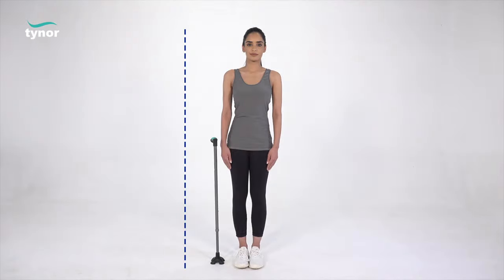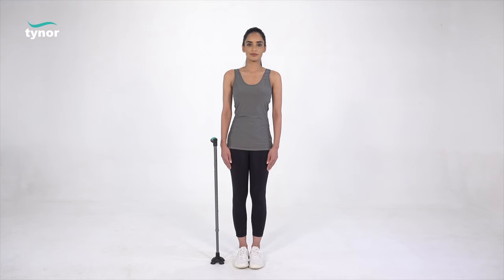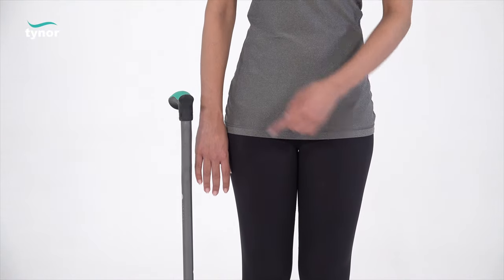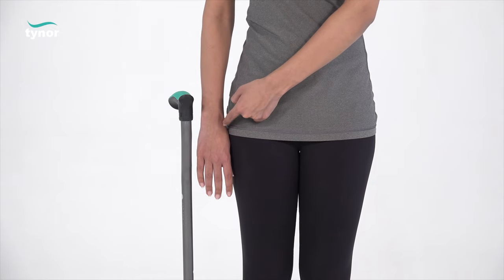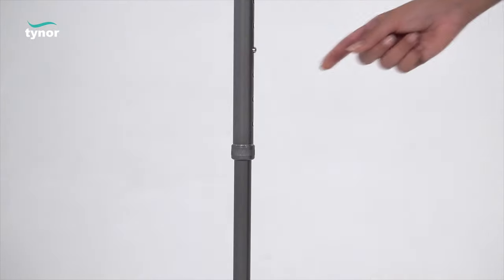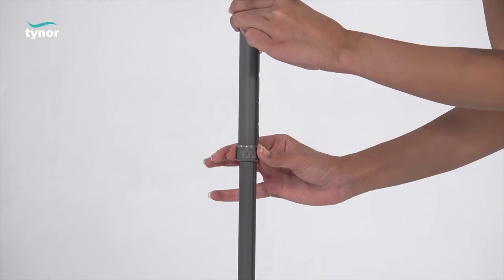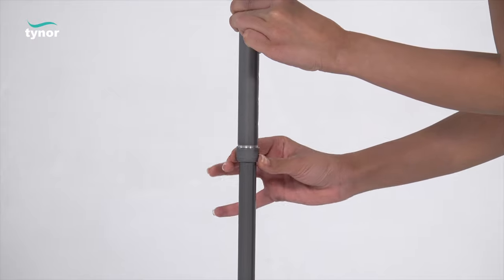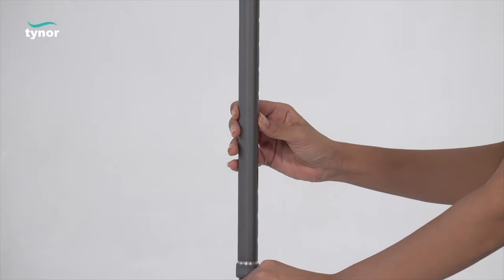First we will see how to adjust the height of the walking stick tetrapod. Stand straight with shoulders relaxed and arms hanging loosely at the body side. The position of the hand grip should be at the wrist crease. To adjust the height, loosen the nut, press the spring button, and lengthen the telescopic tube to achieve the proper height.